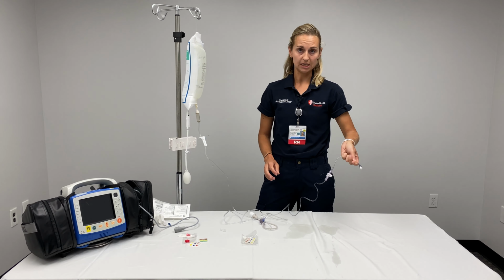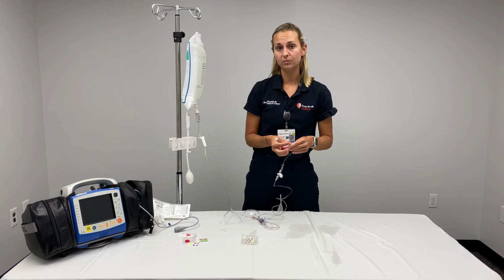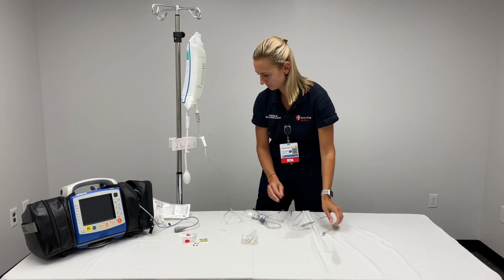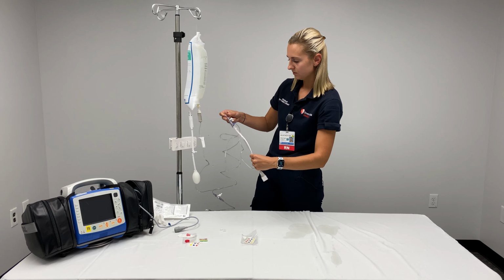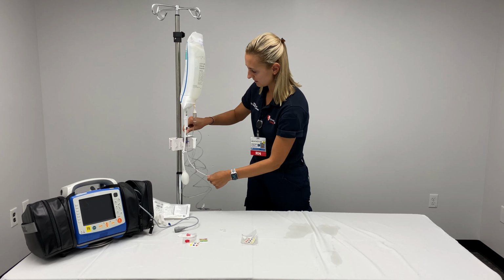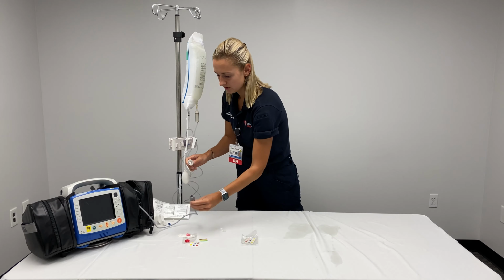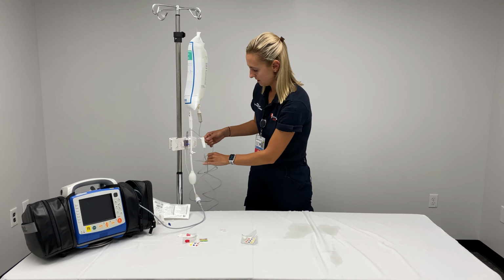You're going to hand this to the doctor, who is going to either connect it to the A-line they're working on, or you're going to exchange it out with the A-line that's already placed. Next, you're going to hook your main port with the monitoring tail. I like to think of it as a dog tail down. And you're going to hook it up to your monitor just the way it fits, and you are ready to go.